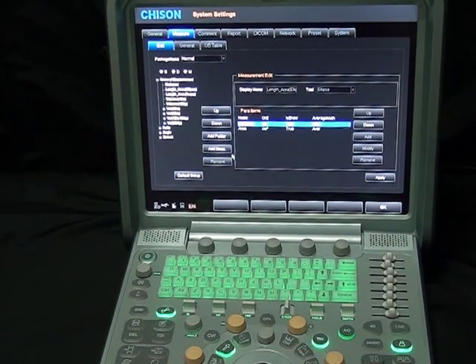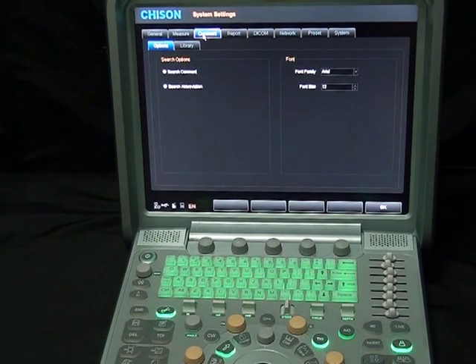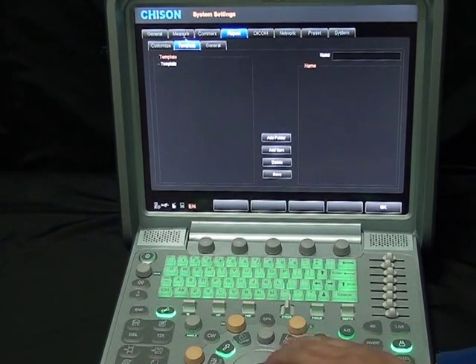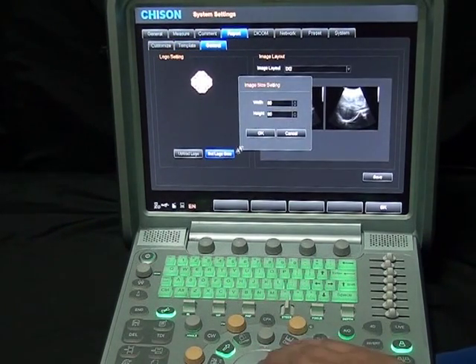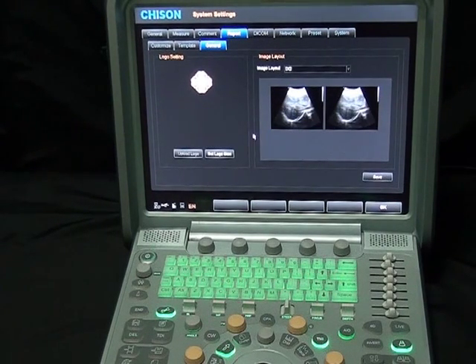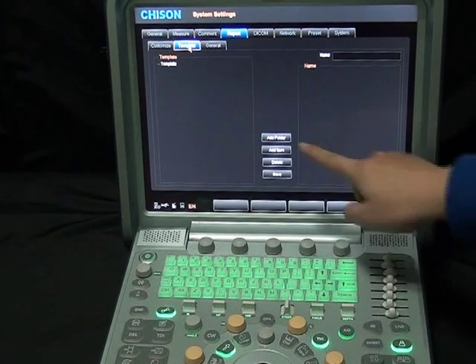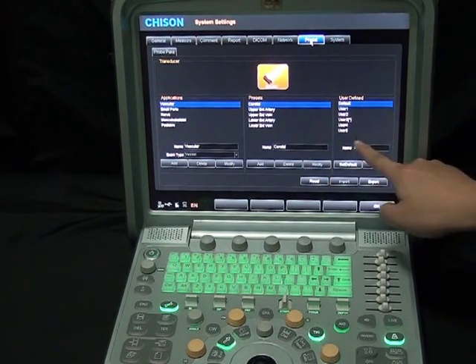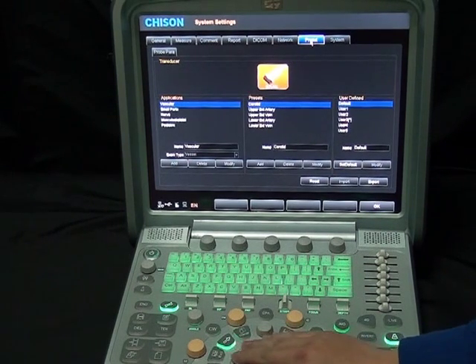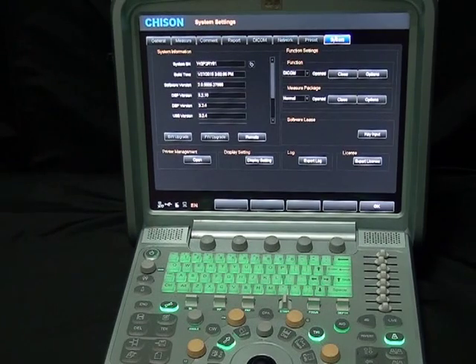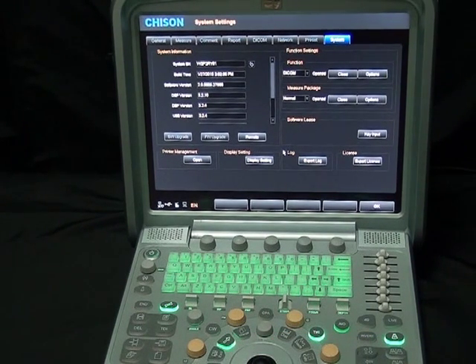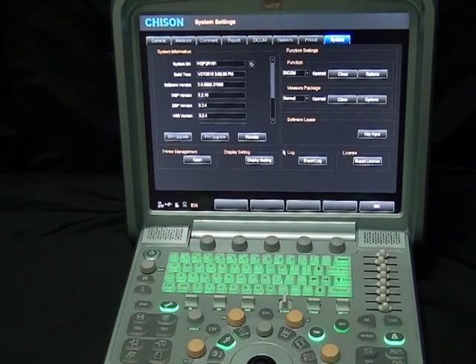In the comment interface, you can add or delete comments for each preset, as well as set the font and font size, making your comments look specialized. In the report setting interface, you can set the hospital logo and layout to make your report more personalized. A report diagnosis template is also available, which is very convenient for doctors' daily work. Unlimited user-defined presets are available in the preset interface. The system interface is used for unit maintenance, system upgrade, license control, and system lock. Upgrading is easy: download the latest software to a USB, connect to the system, it is recognized automatically, press one key, and the upgrade is complete.